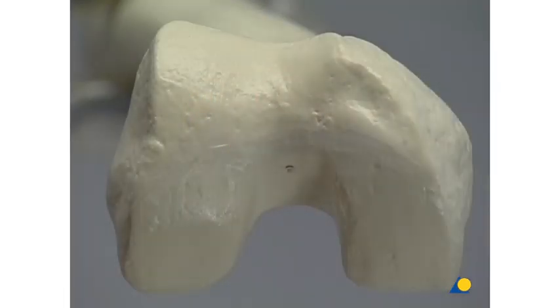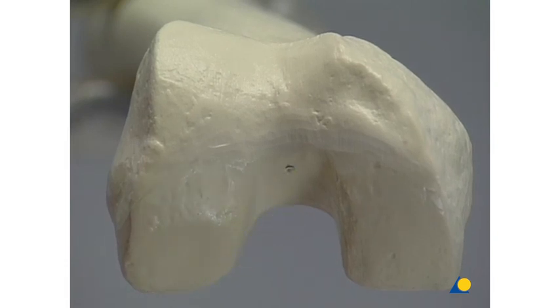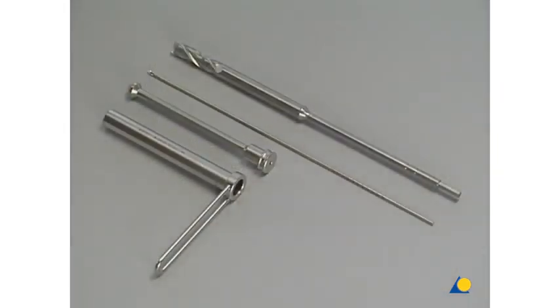The entry point of the nail is in the axis of the medullary canal, just below the crest of the intercondular notch, so it lies anterior and lateral to the proximal attachment of the posterior cruciate ligament. Needed for the insertion of the guide wire and for the opening of the medullary canal are the 17.0-15.0 protection sleeve, the 15.0-3.2 drill sleeve, the 3.2 mm calibrated guide, and the 13 mm cannulated drill bit.